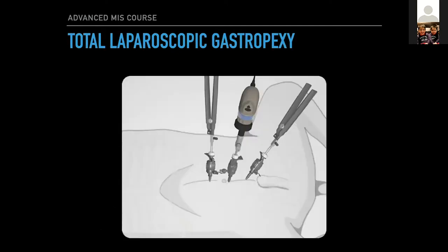Because of wound complications and wanting to push the envelope, we came up with a variation doing total laparoscopic gastropexy, which involves intracorporeal suturing. One big advantage is that all ports are on midline — I really try hard to put all ports on midline for any procedure because you're right on linea and it's unlikely there will be wound complications. Intracorporeal suturing is difficult and has a steeper learning curve, but it's a lot of fun and really fulfilling.